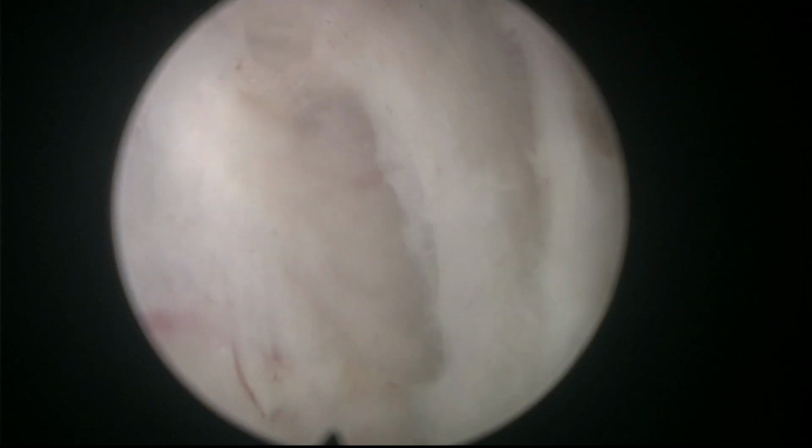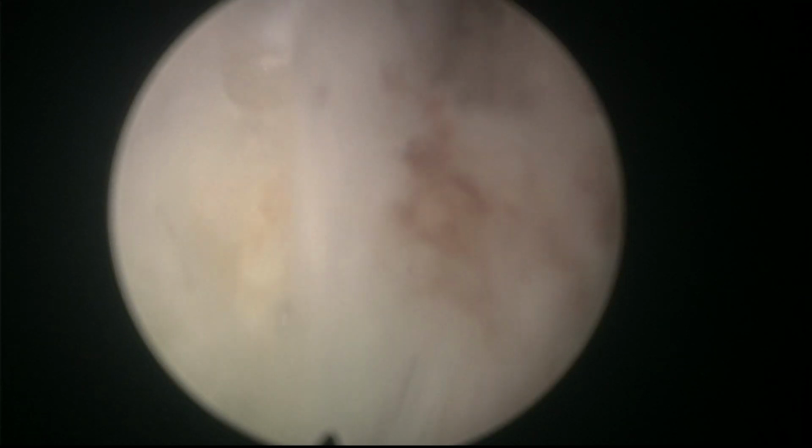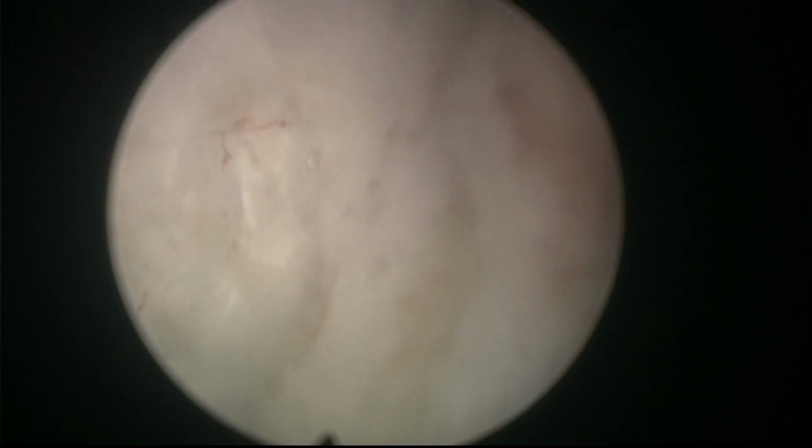Look at that. It's a big prostate. You see, I am positioning myself right at the edge, trying to keep the line of attack in the middle of the screen, so I can see both adenoma on one side and capsule on the other side, and I can develop this plane very carefully. I don't use force at all.